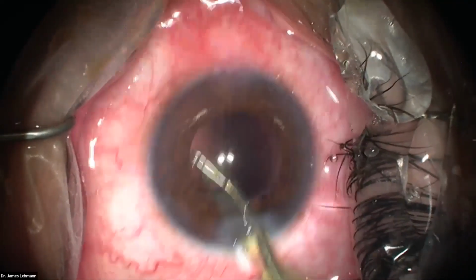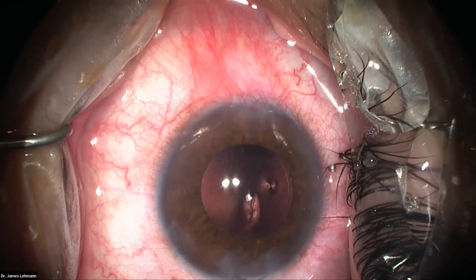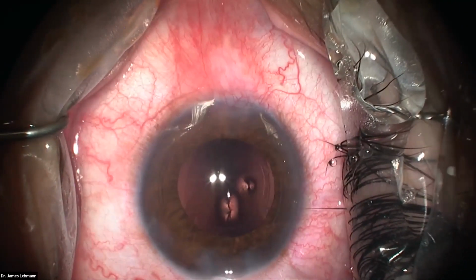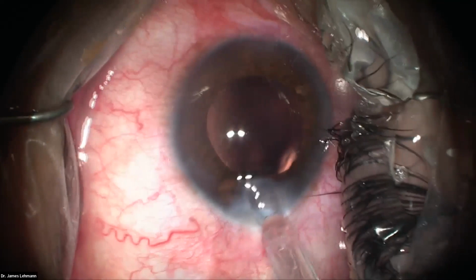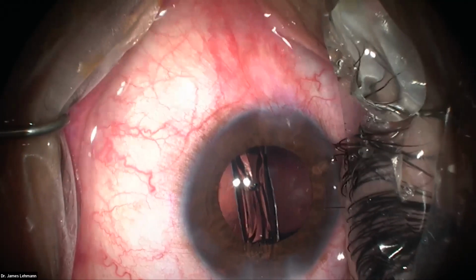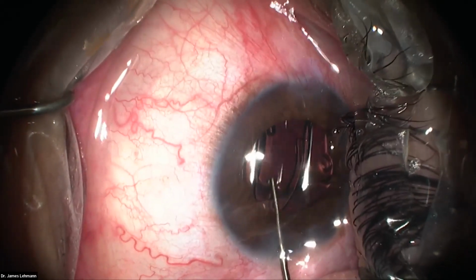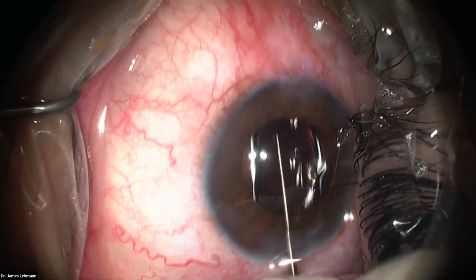Okay. All right. Now I'm going to put in the cohesive viscoelastic. Those are just some little cortical remnants on that cornea there. I'll wash them off here. And then, okay, now we're inserting the lens, also a single piece acrylic lens. Insert it straight into the capsule there, remove that, use a second instrument, spin it into the bag, basically just push posteriorly, make sure it's good, and then free up those haptics. Once you see the haptics moving, you're good.